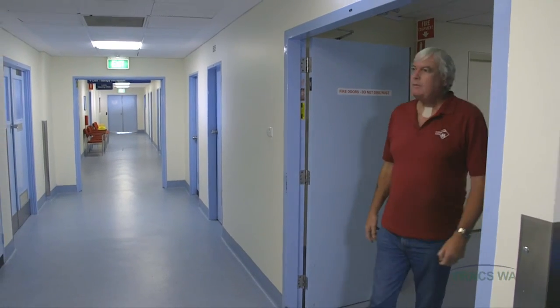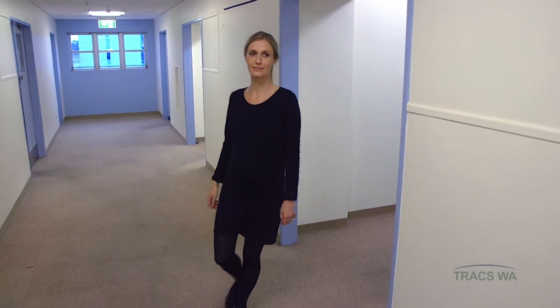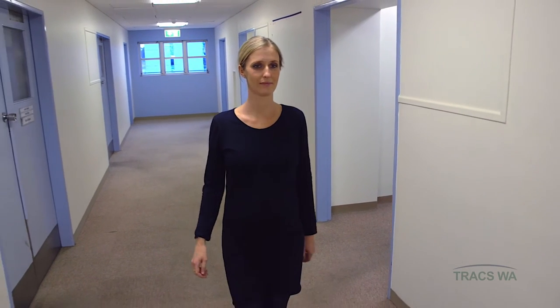In this scenario, 61-year-old Matt has undergone a total laryngectomy for recurrent subglottic cancer. Today he's visiting senior speech pathologist Peter Graciot to assess the problems he's having with his voice.